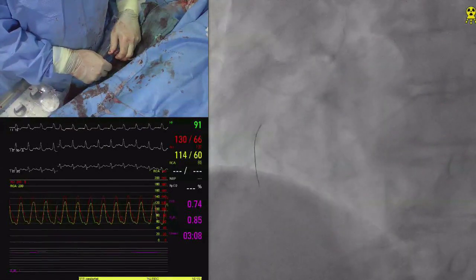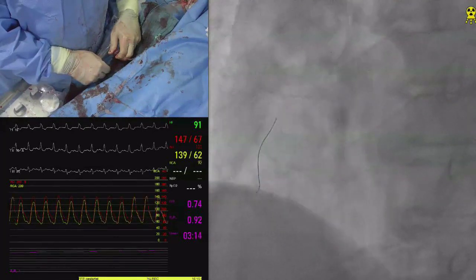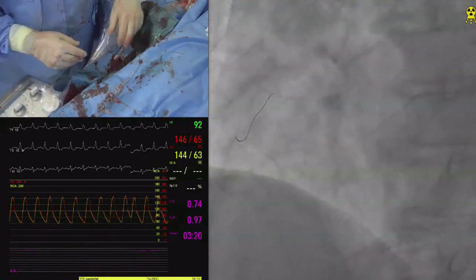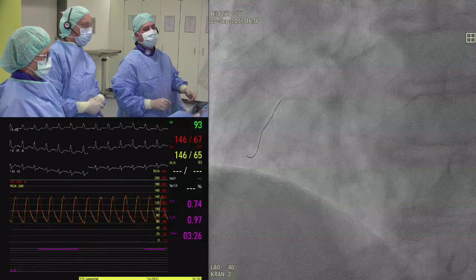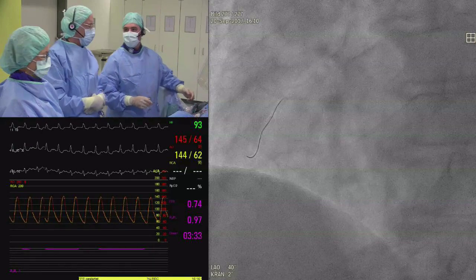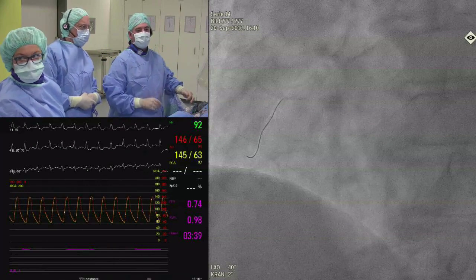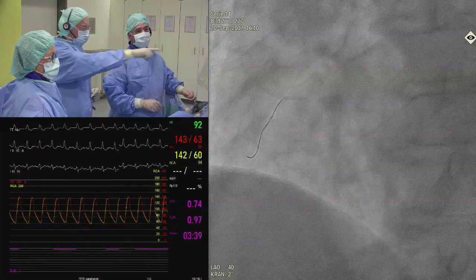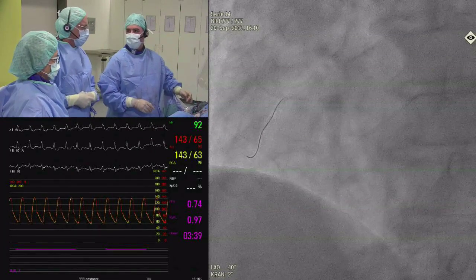So I guess you're doing the pullback now, right? Exactly, correct. We're right into the corkscrew or the Z track at this point, and that's where you see the gradients disappearing. So I think it was pretty obvious. I don't know if you guys could see that in the audience, that actually the mid, right at the elbow. Exactly. The mid right coronary artery, as expected, was the one with the biggest drop in the FFR. Do you think we have the resolution to tell which part of that bend it is? It's hard to tell, to be honest.